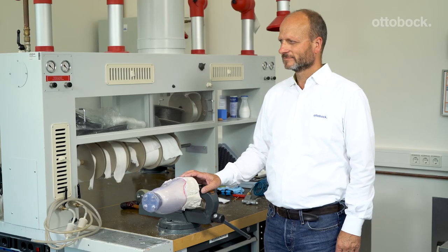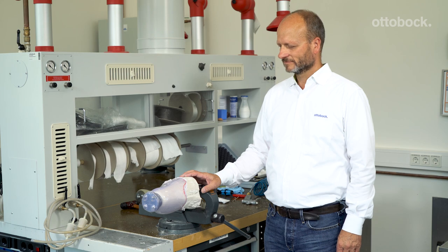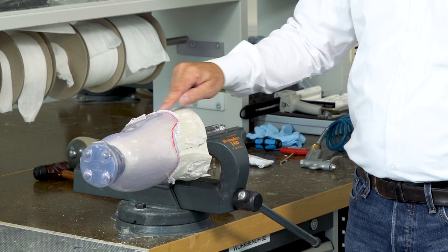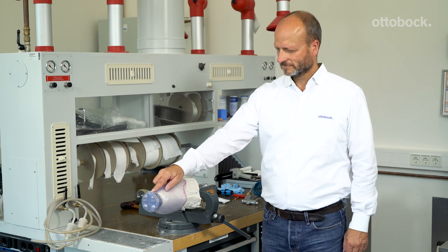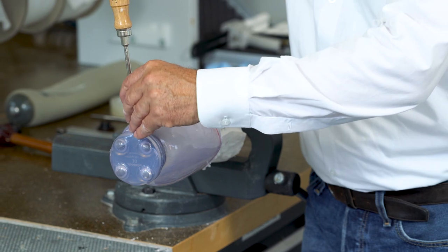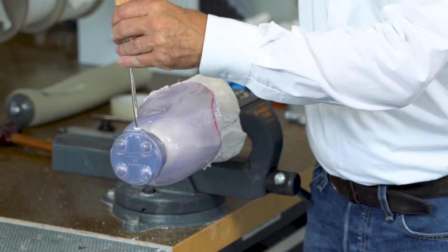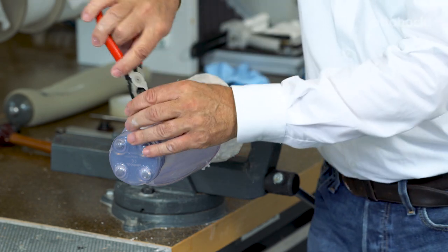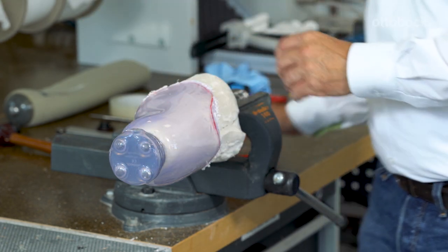Follow these next steps to remove the plastic check socket from the plaster model. Cut through the plastic according to your trim lines. Grind the surface over the valve dummy to just expose the slot for the screwdriver. Remove the dummy and apply compressed air through the remaining hole — this will pop the check socket off the plaster model.